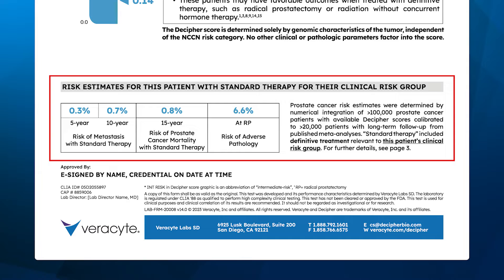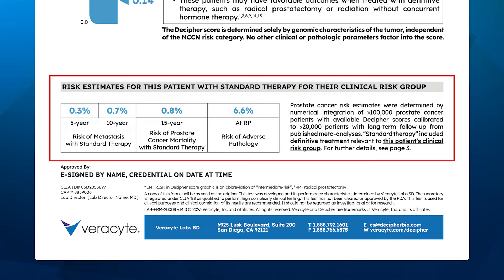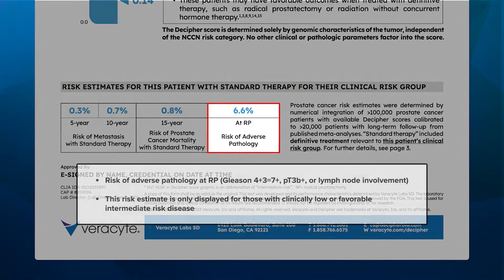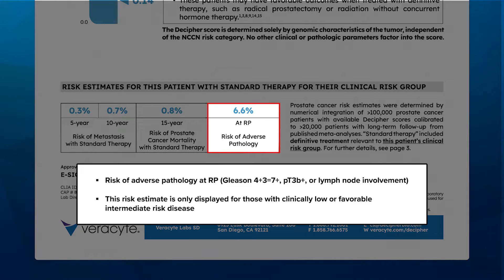At the bottom of page one, you'll find the section containing risk estimates relevant to this patient. These prostate cancer risk estimates were calculated based on thousands of prostate cancer patients treated with standard of care therapies with available Decipher scores, and have been calibrated to large cohorts with long-term outcomes. In the biopsy report, the metastasis and prostate cancer mortality risk estimates are calibrated to patient outcomes treated with definitive therapy appropriate for patients within the same NCCN risk groups. The risk of adverse pathology at radical prostatectomy — including Gleason grade group 3 to 5 disease, pathological stage T3B or higher, and lymph node involvement — will only be displayed for patients with NCCN low or favorable intermediate risk disease.